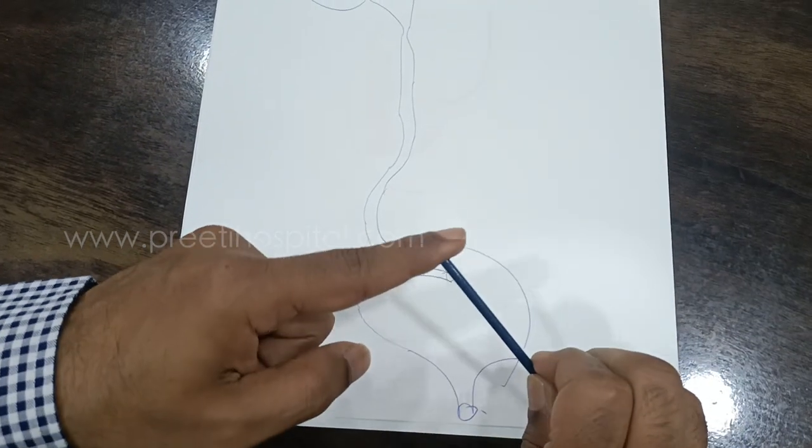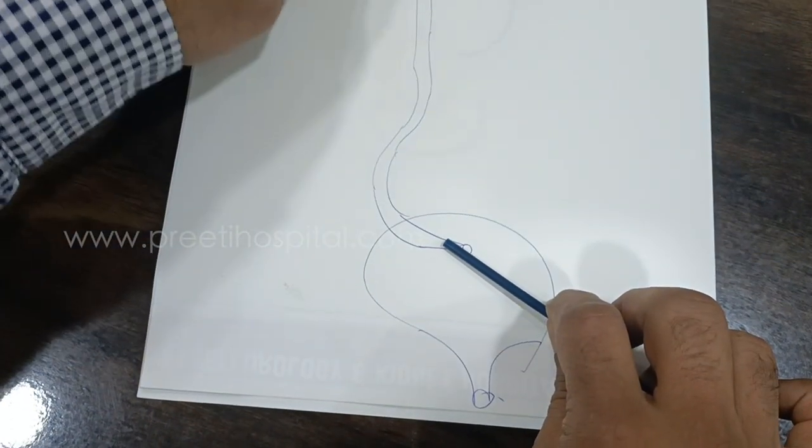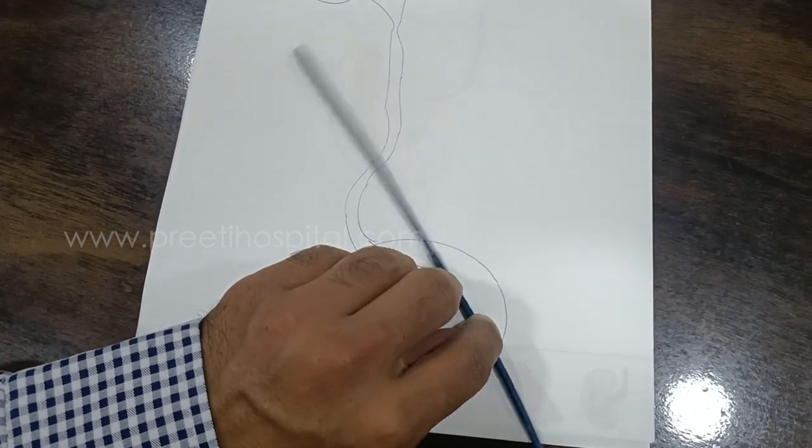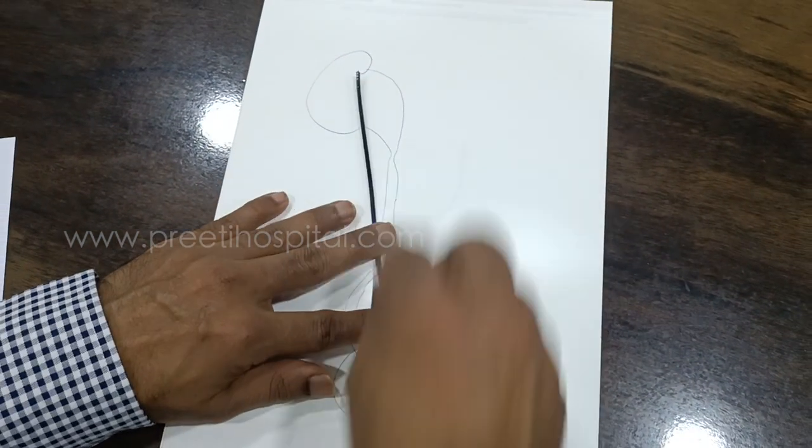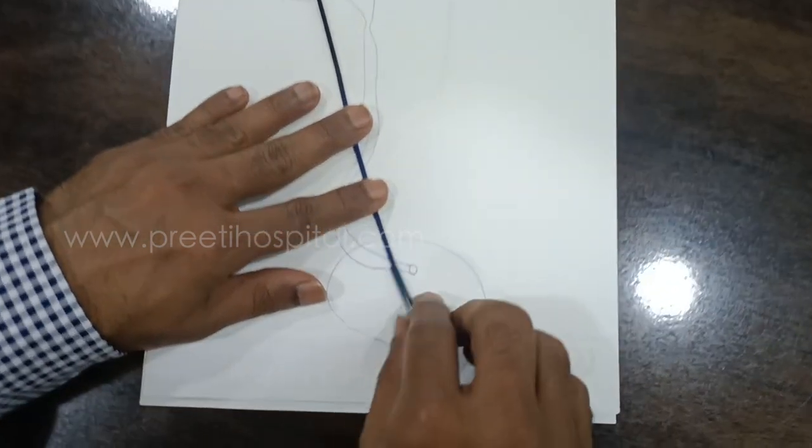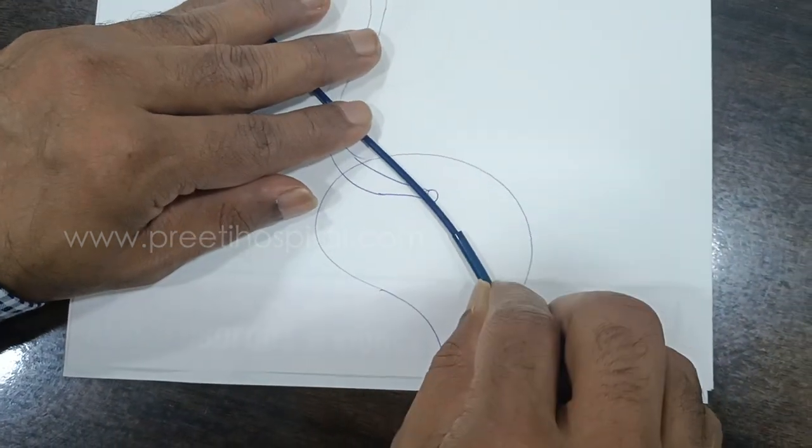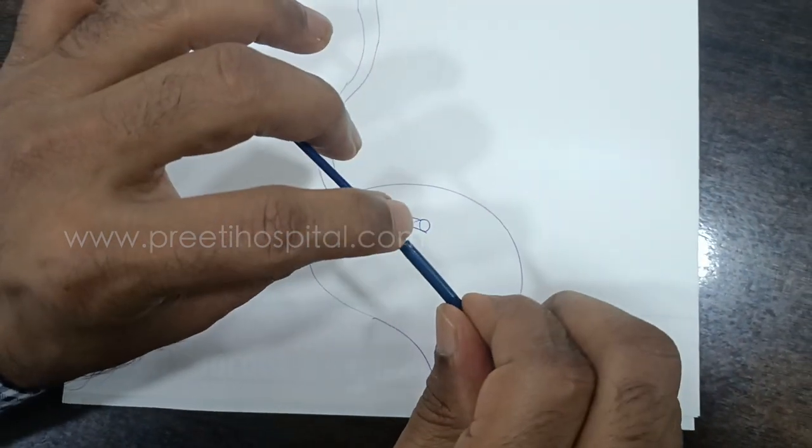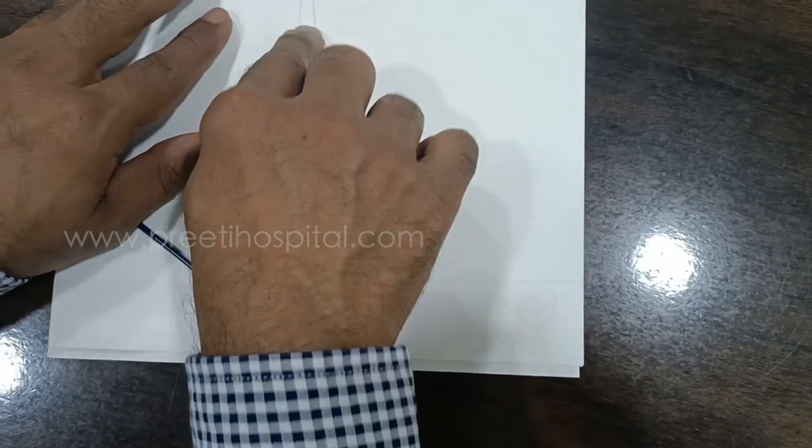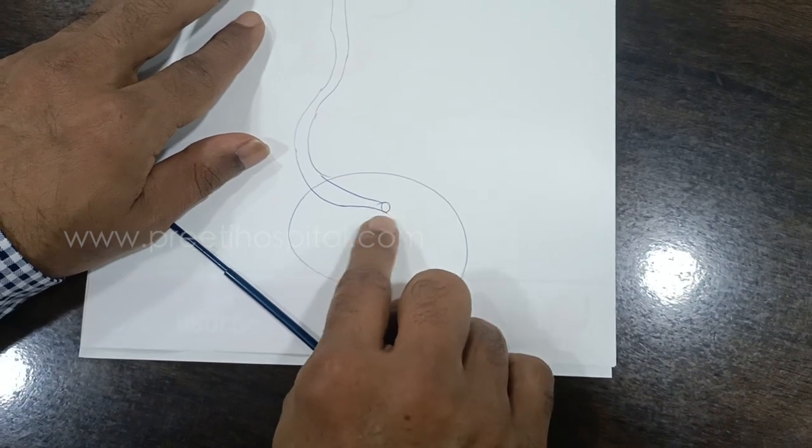The problem is this sharp part will be abutting the mucosa and damage when you are doing surgery here. You will be going with flexible scope like this inside, but here this sharp edge will be damaging the intramural part and it slips also. If you try to negotiate, there will be some small space between these and it may damage. So if the ureter is tight, put a stent, but don't try to manipulate with access sheets at the entrance of the UVJ.